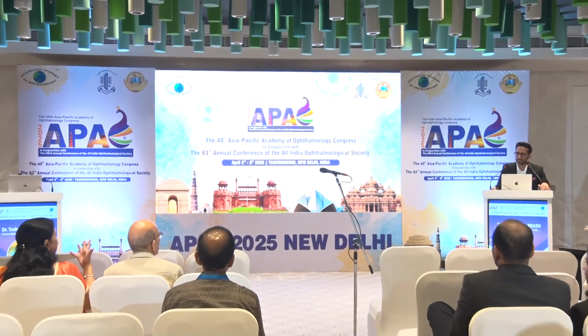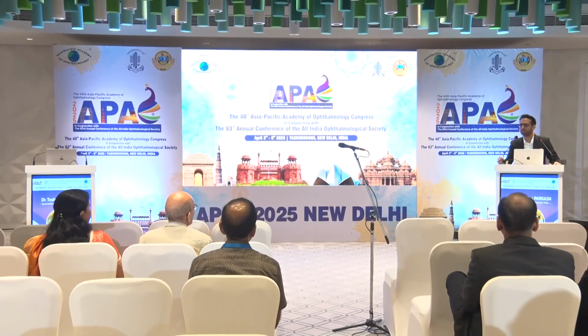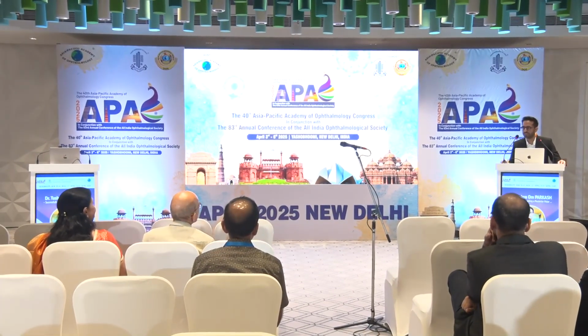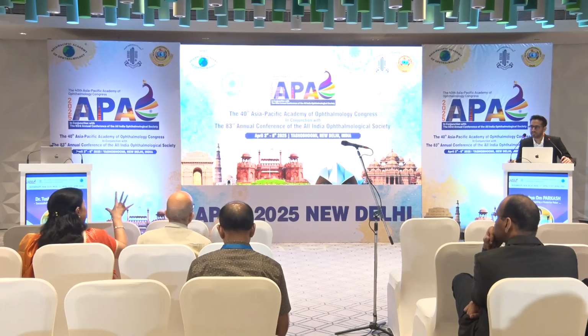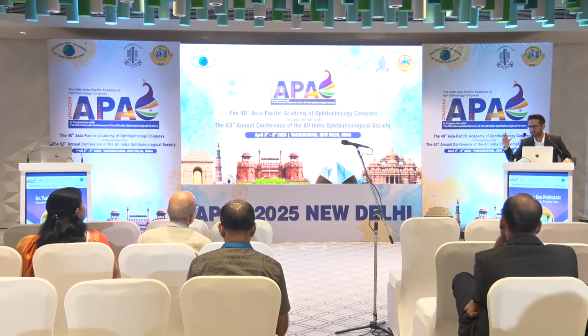Yes, ma'am. Yeah, so I've tried it in a few. That's why I go through the side port. Make sure that the chamber is not overly inflated, just adequate. Yeah, at times it is through and through, so you can't do it in that. But if you have a smaller one, you can try.